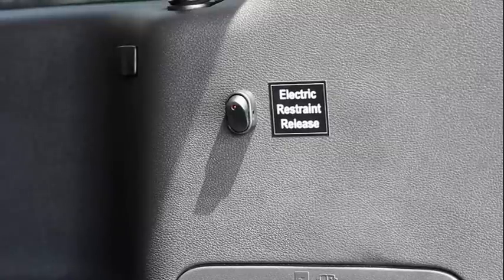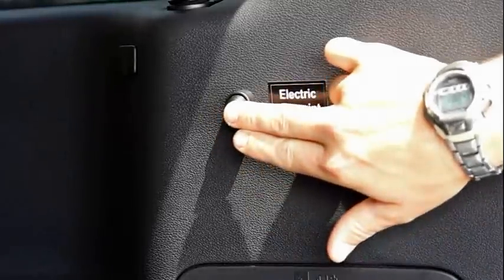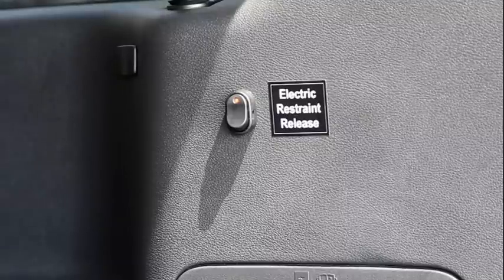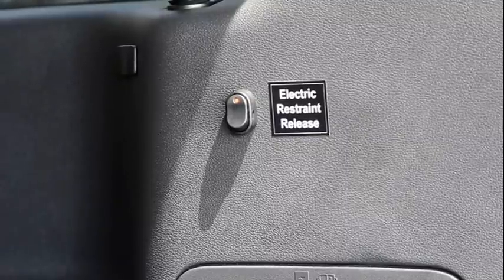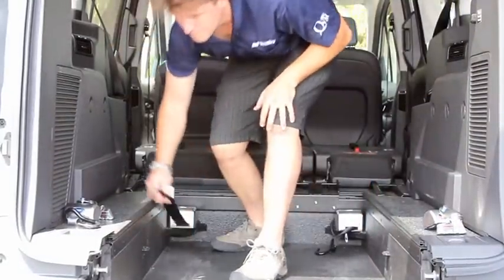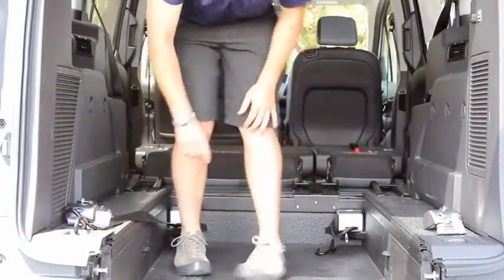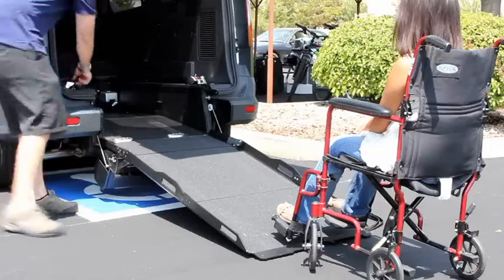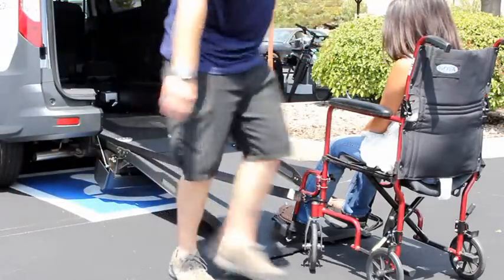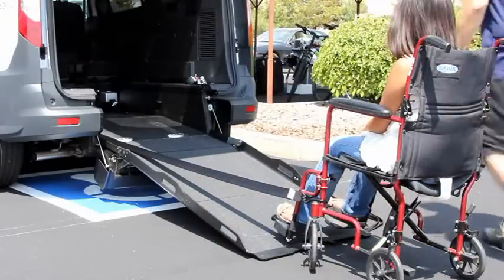If using electric retractors, flip the switch located on the passenger side of the vehicle to the on position. This will be indicated by a red light, allowing the retractor belts to move freely. Now pull the hook and attach it to the cargo loop. Repeat on the other side. Attach the hook securely to the appropriate places on the wheelchair, and repeat on the other side.